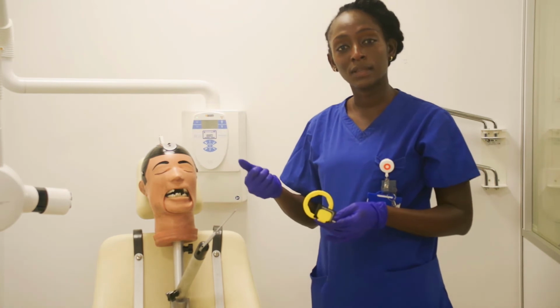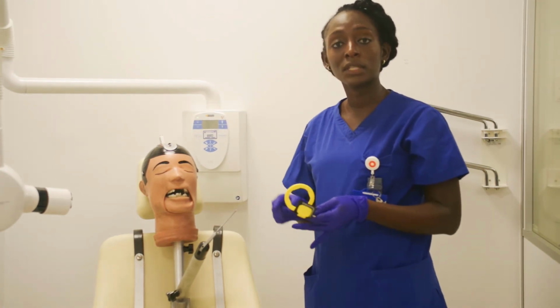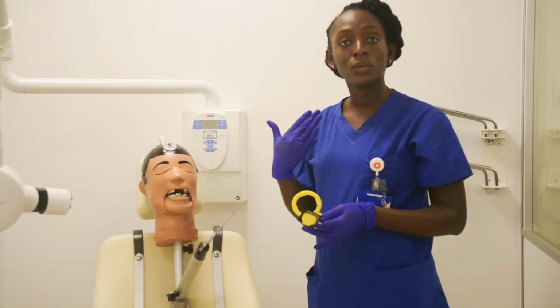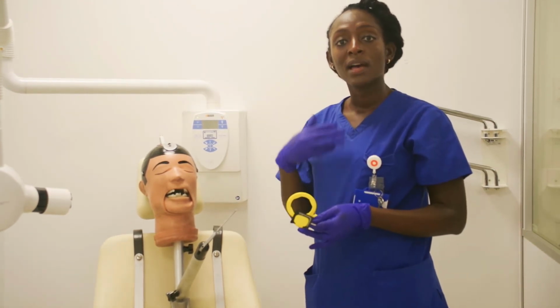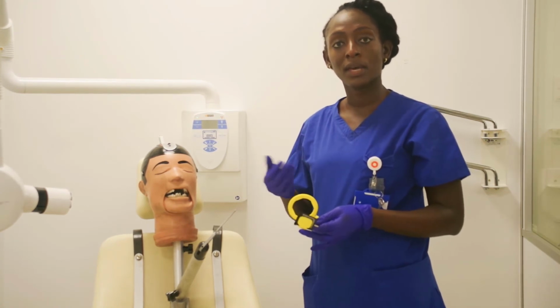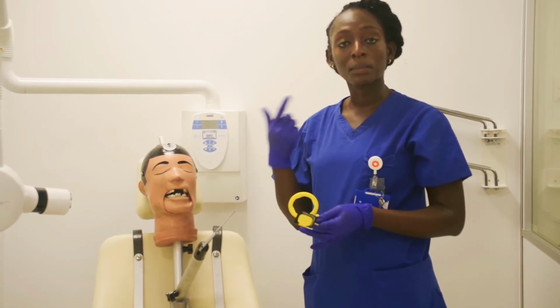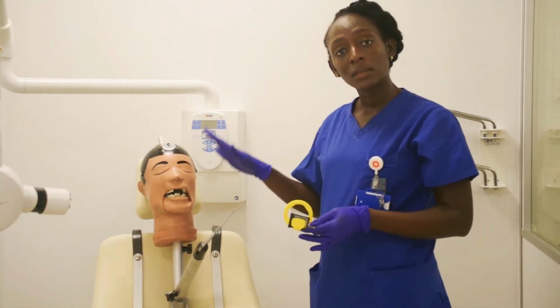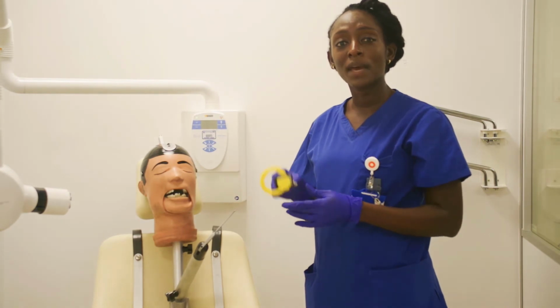Okay, so that is Dexter, and remember that you have to go through all your preparation, and we mentioned this in the lecture. So you'd want to ask the name, date of birth, you'd want to confirm the sites that you're going to take the x-ray of, ask Dexter if they've got any removable prosthesis from the mouth, i.e. dentures or tongue piercing or anything of that sort.